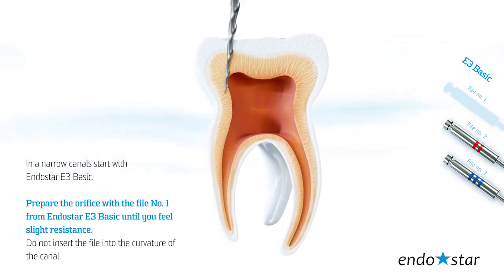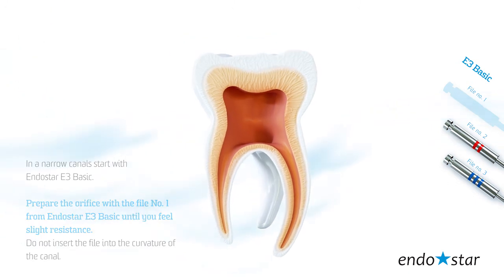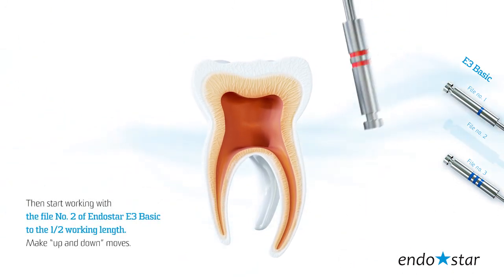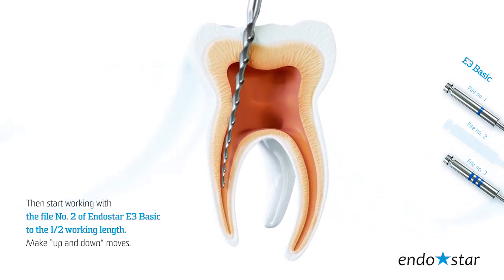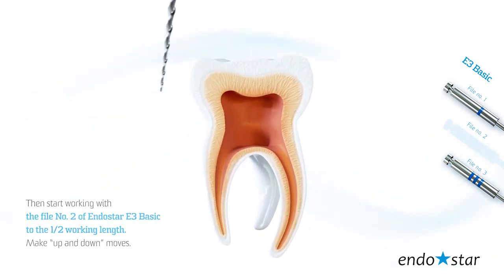Do not insert the file into the curvature of the canal. Then start working with file number 2 of the Endostar E3 Basic to 1 mm short of working length. Make up and down movements.